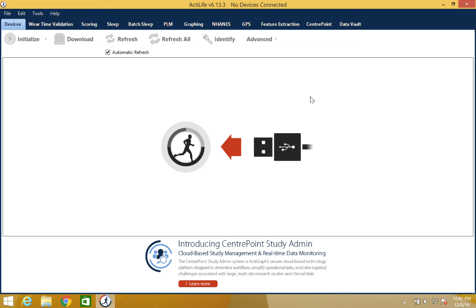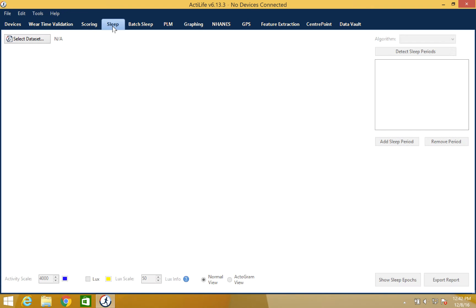To begin, please open the ActiLife software and click on the sleep tab. Now you may select your data set.